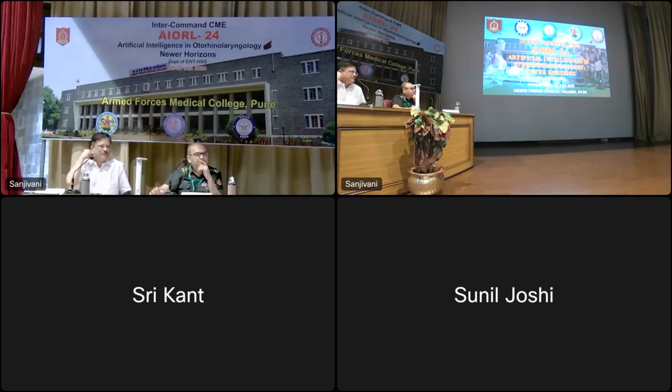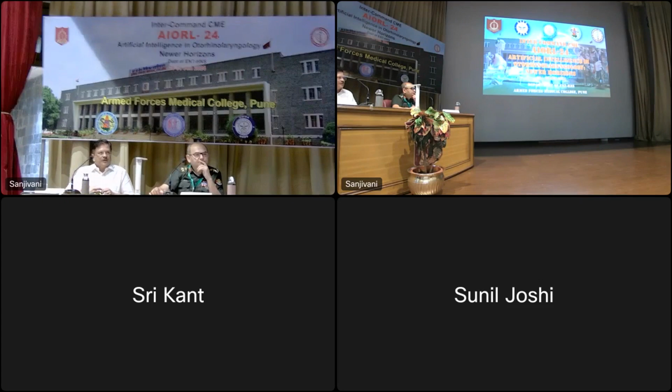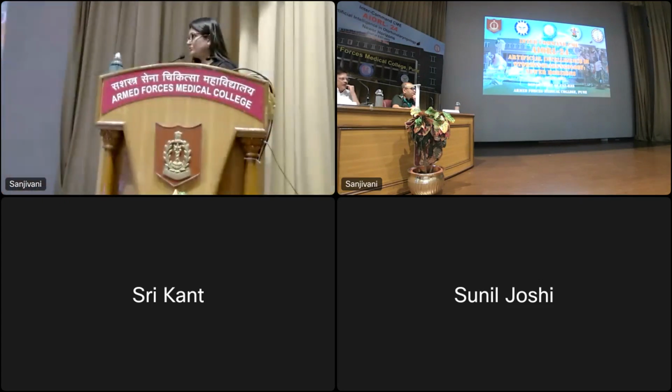Sir, actually, different lengths of electrodes are already available. So somebody's CT is done and their cochlear duct length is measured as, say, 32 mm or 29 mm. Based on that, one electrode that is already available is chosen, because different implants come with different electrodes. With what I have displayed right here, all the implants that we have come with all the electrode options.